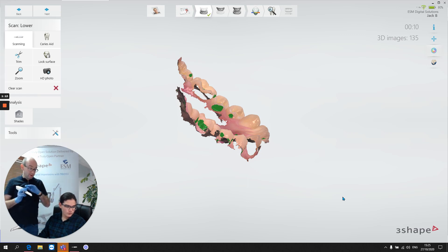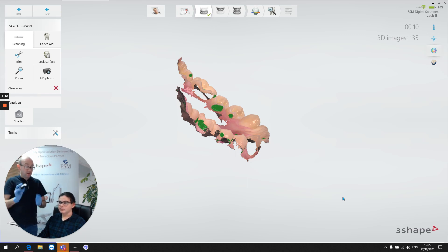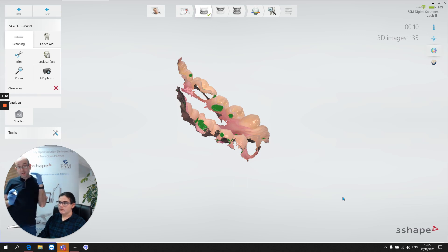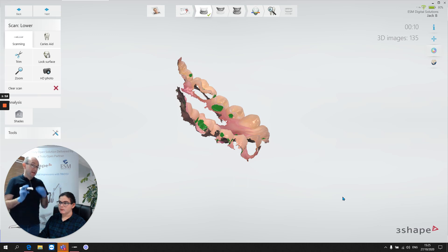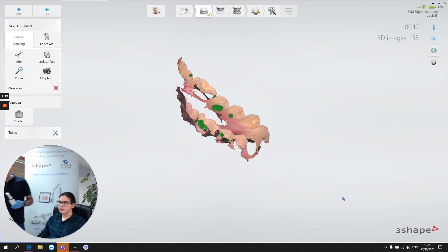We're not going to rock over the scan, over the arch as we sweep around and try and capture buccal and lingual at the same time. It's one steady sweep all the way around the arch, make sure we capture the occlusal detail, and a little bit of buccal, and a little bit of lingual. So that's a really good occlusal scan that we've got there.